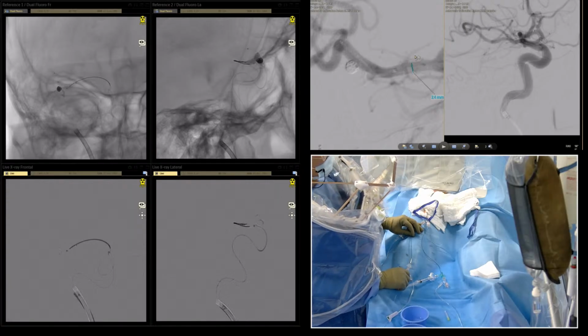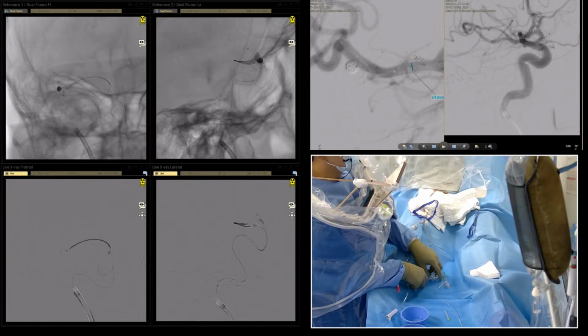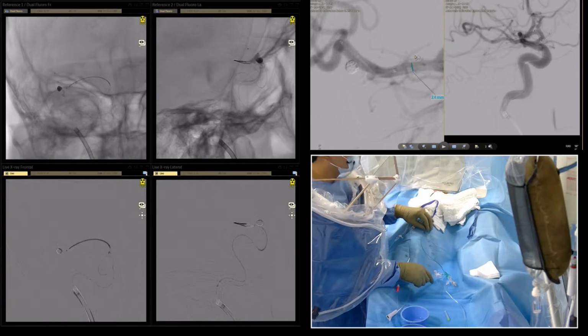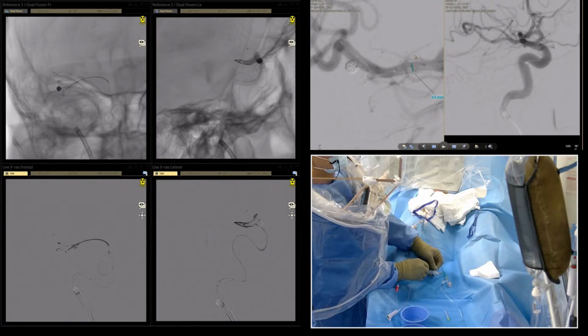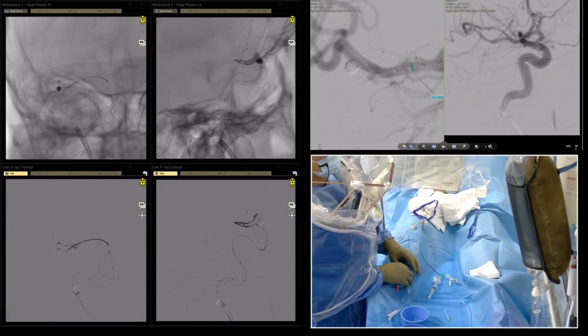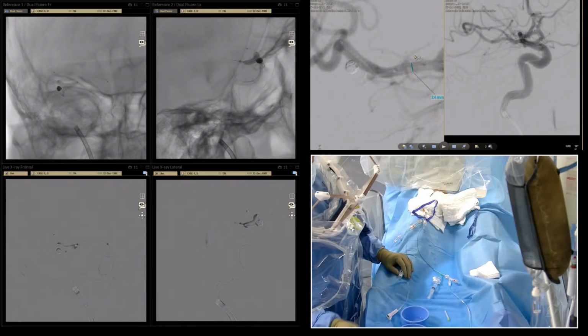The orientation at just this point, huh? Should we replace the balloon a little bit? Maybe. Maybe yes, maybe not. Okay, no. The catheter is just in place, huh? Should we inject something? Or just inject the liquid embolic, huh?